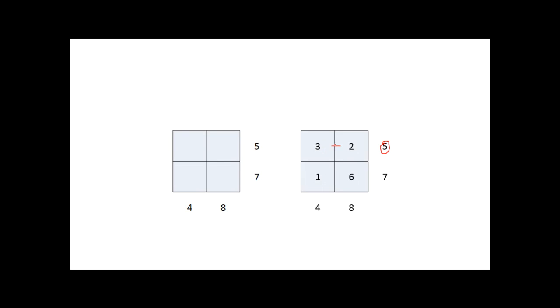So 3 plus 2 equals 5, 3 plus 1 equals 4. It could be other numbers, but it will not be, because the CT machine will also check the values from different angles. So this is how to make sure that each pixel has a certain value.